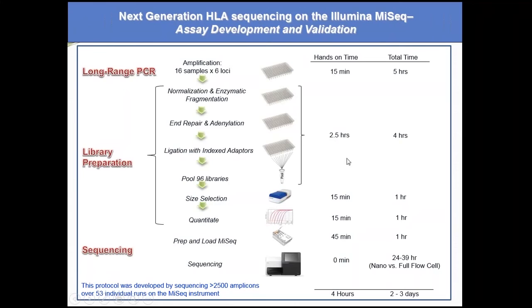This process has approximately 4 hours hands-on time, and depending on what flow cell we use, a nanocell or a full flow cell, it can be from 2 to 3 to 4 days, including analysis.